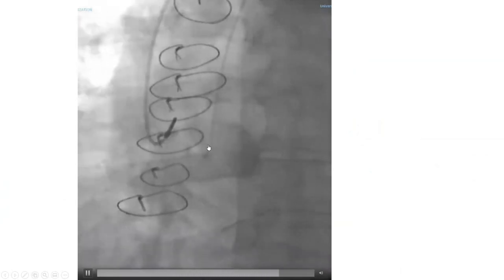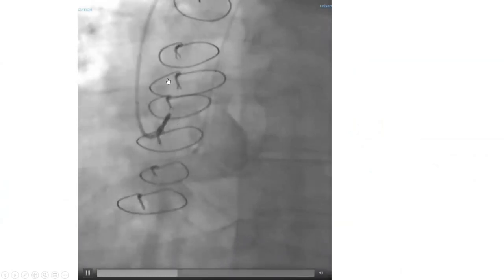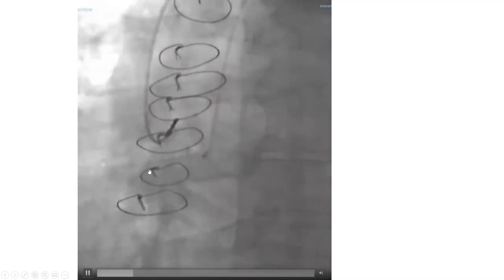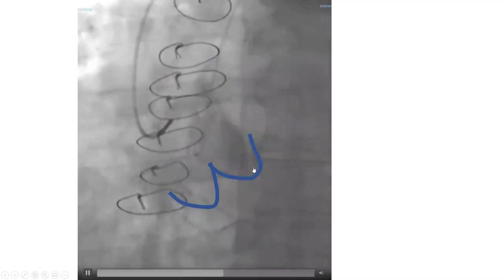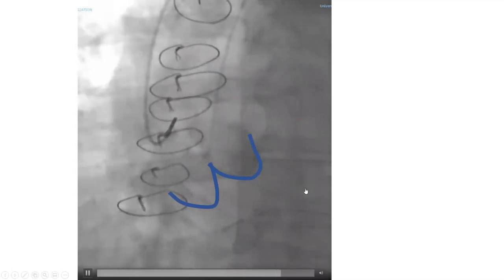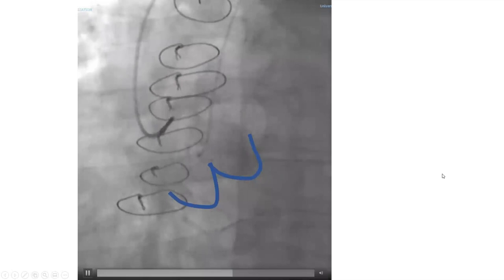Luckily the Judkins right is not a very sharp catheter, so you can pull it out, torque it a little bit to make it look toward you, and push it down. Most often you don't need a wire — you can just push it down to the valve, right cusp, and engage. Dr. Rossen mentioned that in some cases you need to imagine anterior versus posterior as well, and in cases where you keep failing despite all those maneuvers, you may use an RAO view.